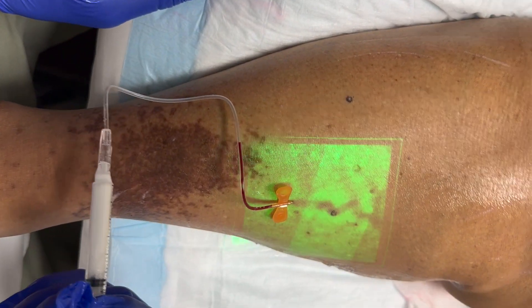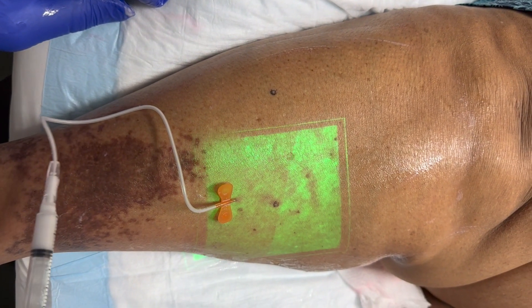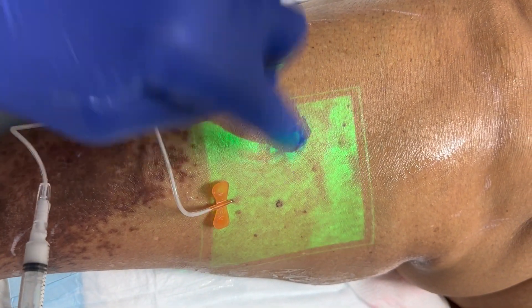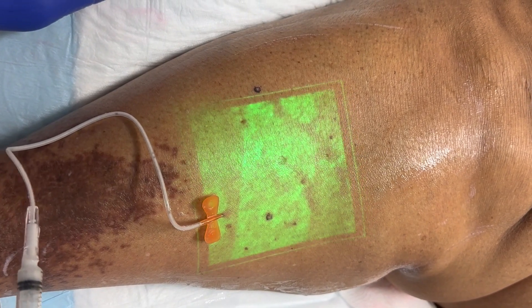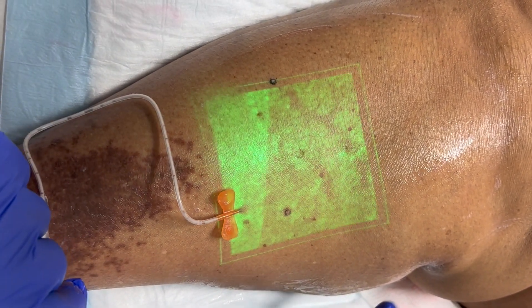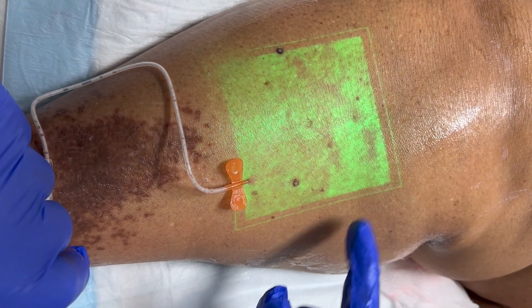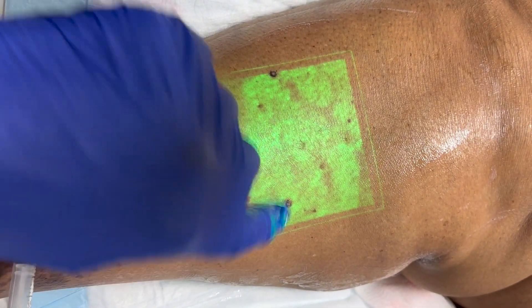Now I'm injecting Varathena going back towards the GSV. I made a little mark here. We're actually going to do a little phlebectomy in two places. The reason is that just after we put the Varathena in, the blood will get trapped and be a little uncomfortable. So we'll make a little nick here in a minute after we do this injection, then divide the vein in two places — here and here.